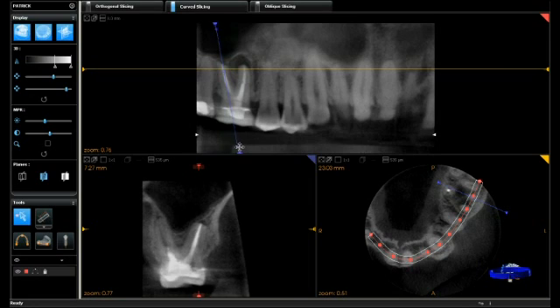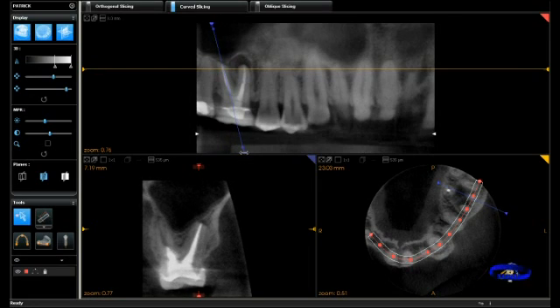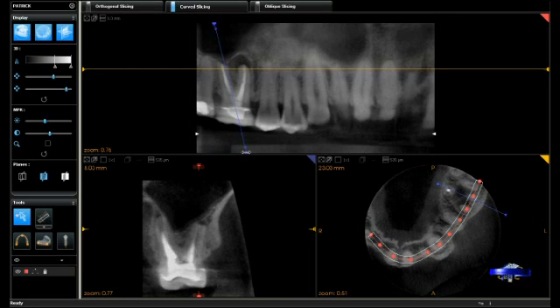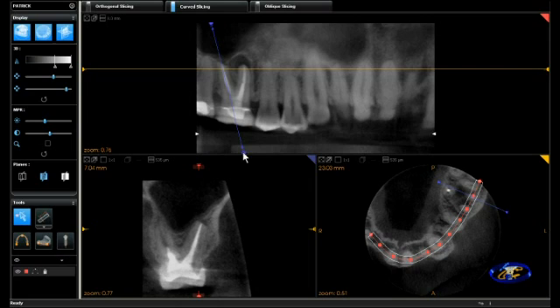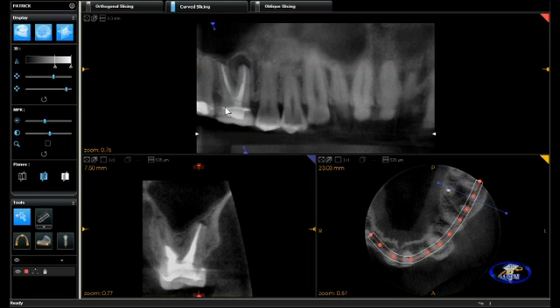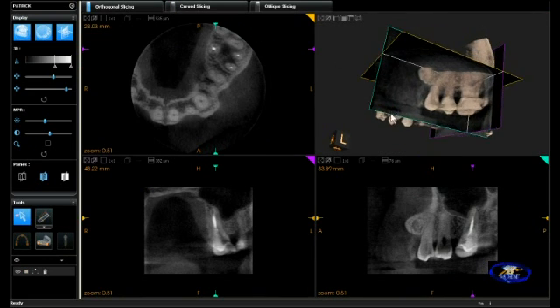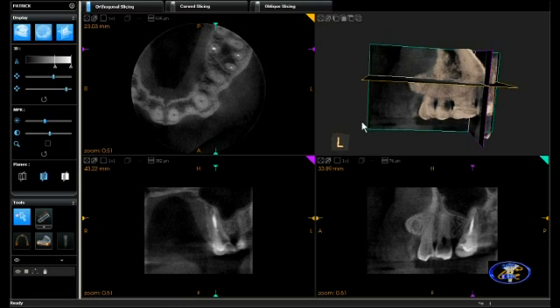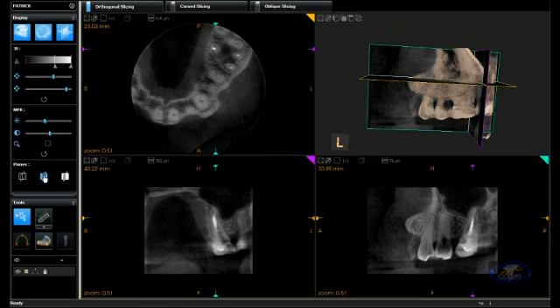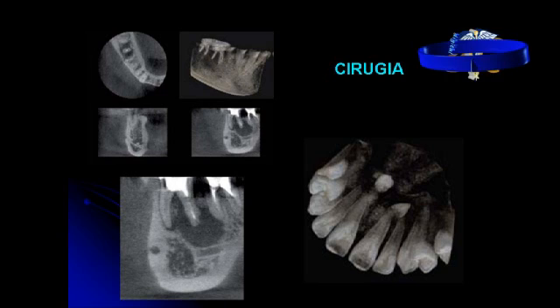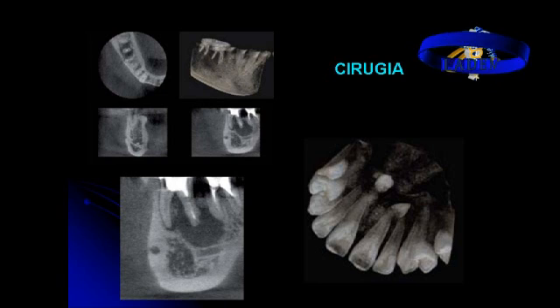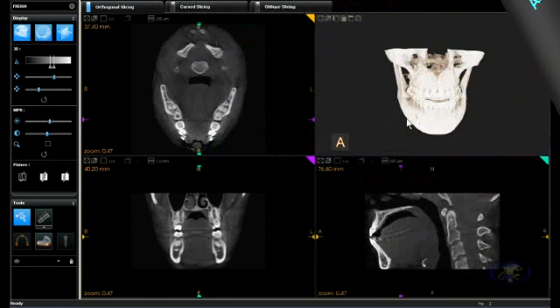On the lower left we can see our cut plane and our cross-sectional slice through both the mesial buccal and the distal buccal root. We can see partially unfilled canals. This particular case was treated successfully for a second mesial buccal canal that was overlooked at the original treatment. That concludes our short presentation on the Kodak 9000 and the clinical application of cone beam CT.